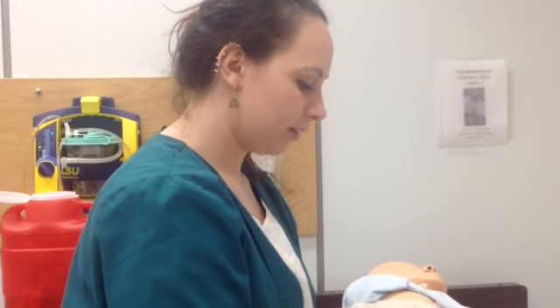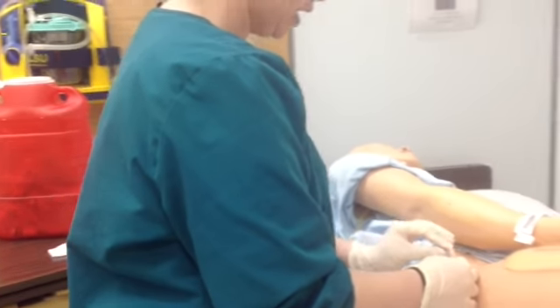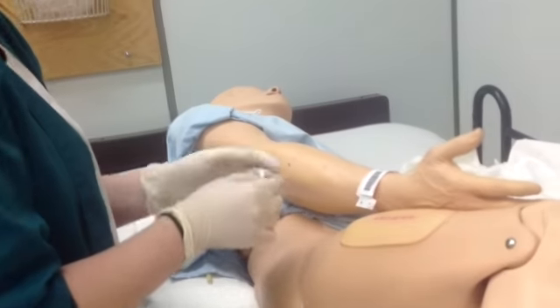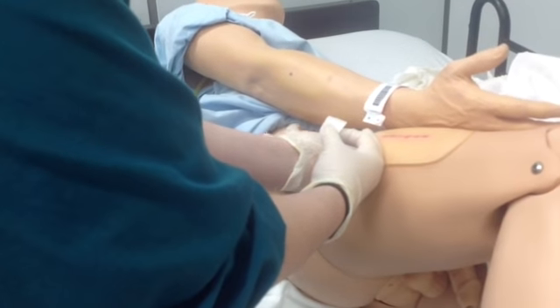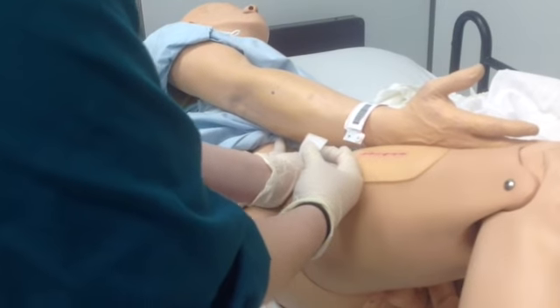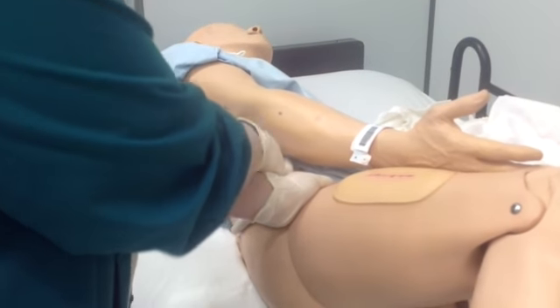So we're going to take the alcohol wipe, and we're going to mark our spot. So again, I'm going to put my hand on the greater trochanter, find the iliac crest. I'm going to spread my arms out. My thumb's going to be towards the pubis region. I want to make sure it's right about here.